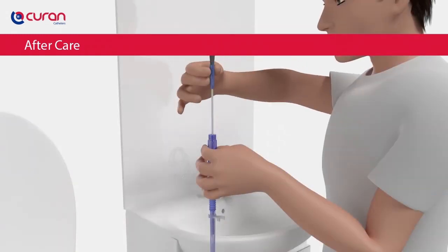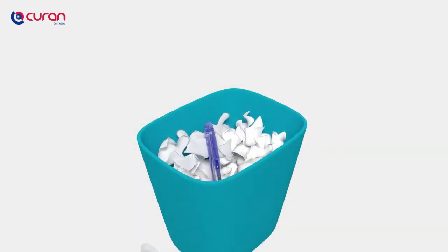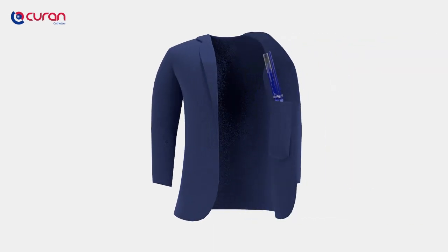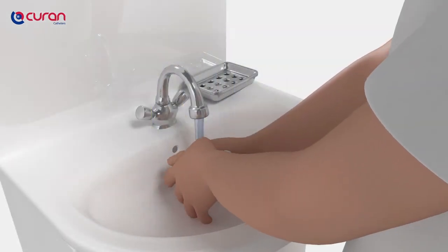You can easily store the used catheter into the packaging of the Curan Man. You can dispose of all materials in the regular waste bin. If no bin is available, you can store the Curan Man in your pocket or bag. Make sure that you close the packaging with the transparent cap. Wash your hands after catheterisation.